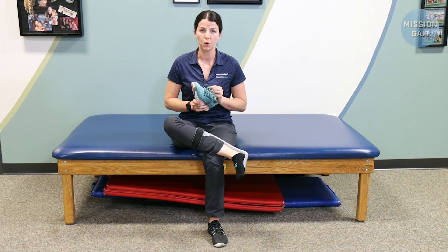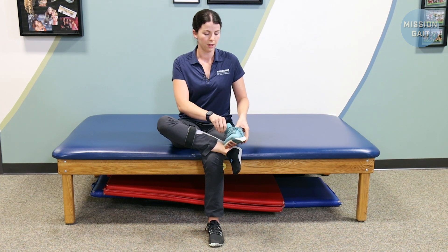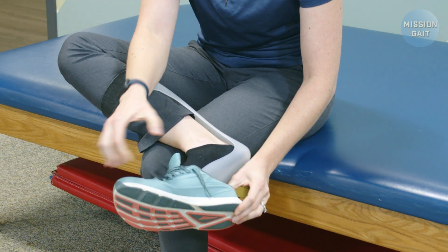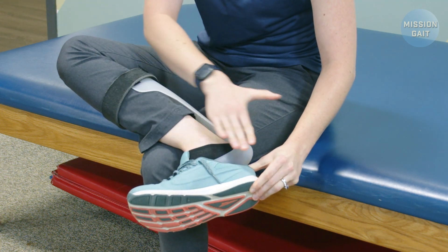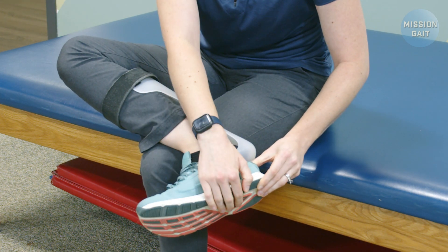When you're putting the shoe on, instead of being very forceful, if you can use more of a shimmying technique — slow and gentle is just going to go a lot better. So we'll just work it back and forth. And then also, as much as you can prevent the heel counter from folding under, the better.